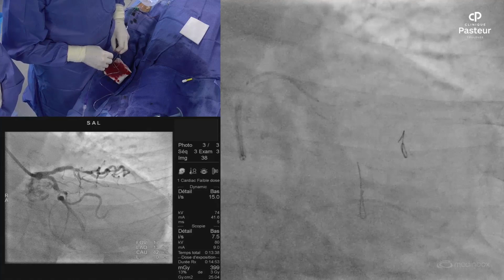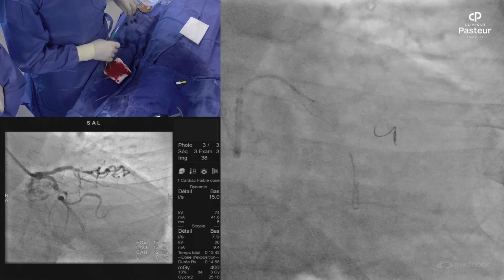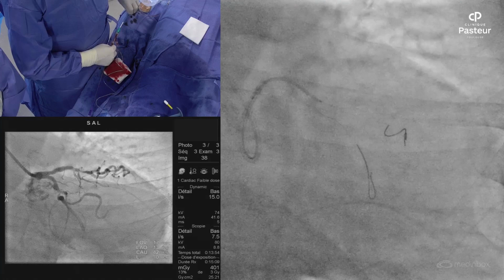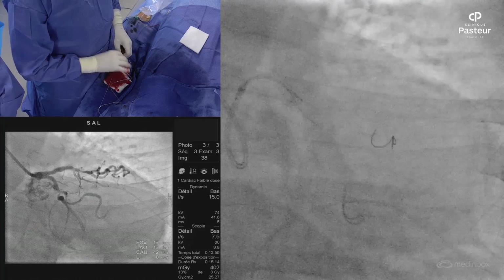So you push the catheter and you push the stent. Yeah, but you see the guiding is... With a continuous pressure. Okay. Yeah. The other possibility is to use a guide liner, to advance the guide liner with the balloon. I try to place the guiding like that, you see. What do you think, slowly. Jim, about an anchoring balloon here?